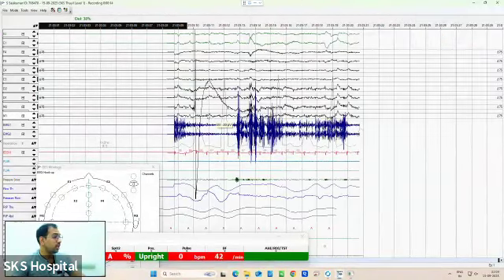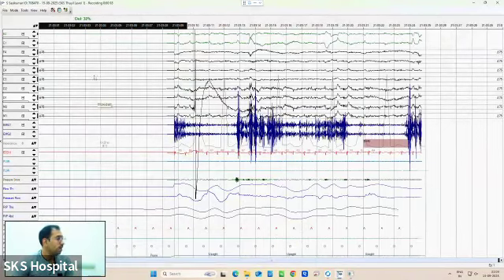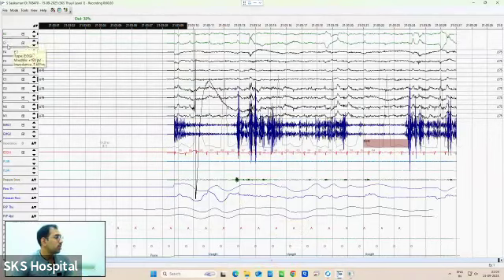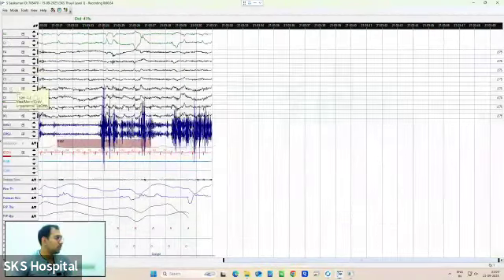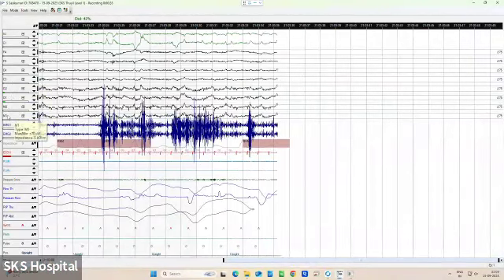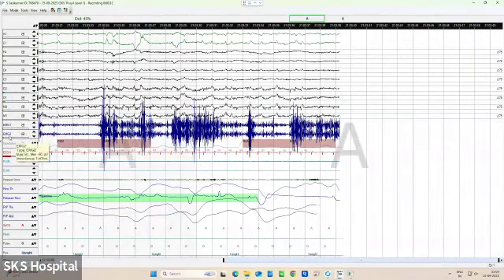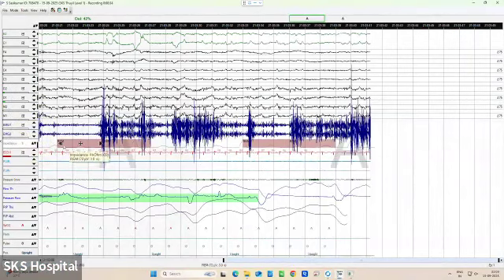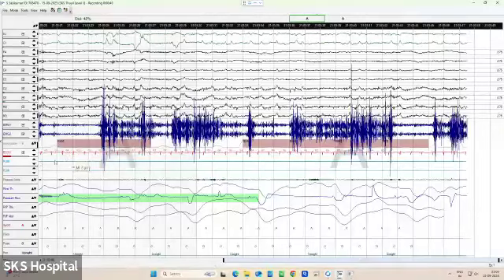So you can see on the screen. So this is E1, E2, which are EOGs. F4, F3, C4, C3, O2, O1 are all EEG, what we know. M1 and M2 are reference leads. EMG1 and EMG2 are chin EMGs. Impedance is the resistance to all the flows. It is the total impedance. ECG is lead to ECG.